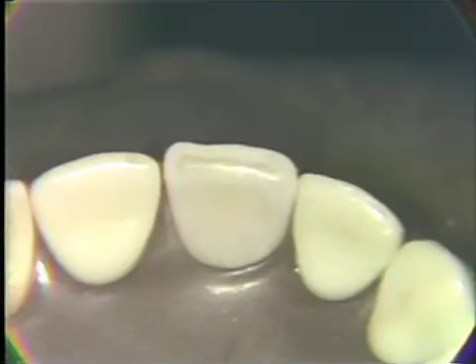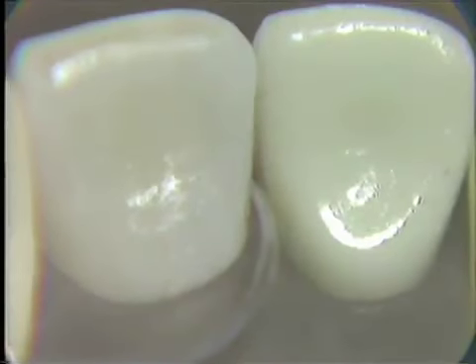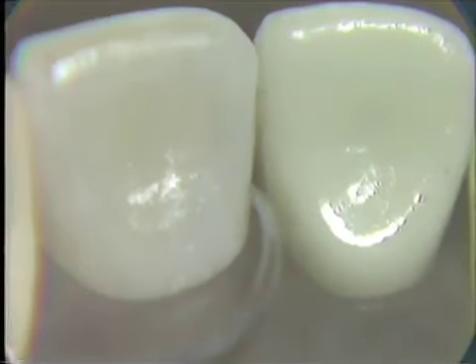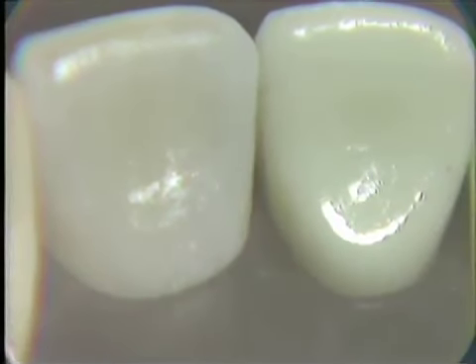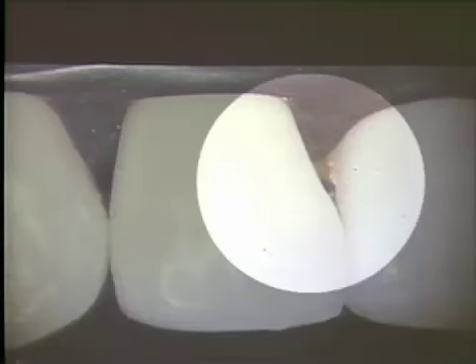Again, the carious lesion is located in a somewhat cervical position. It is in a mid-proximal position immediately cervical to the contact area. If we look at the labial aspect of the tooth, we see that there is a slight projection of the carious lesion through to the labial side.